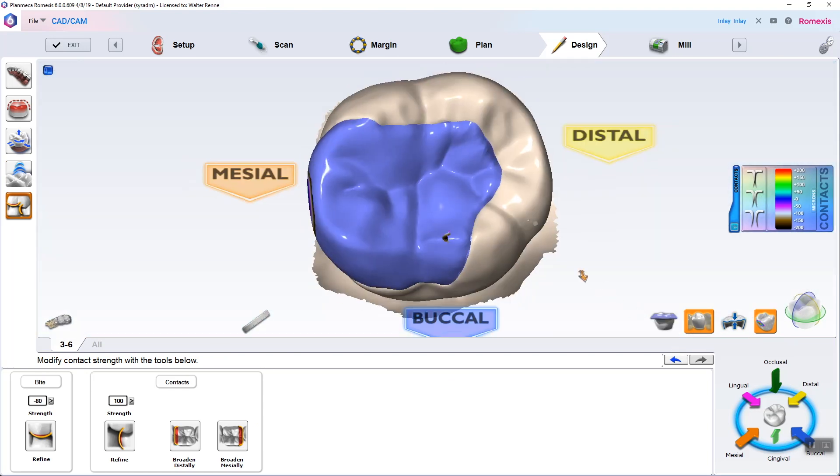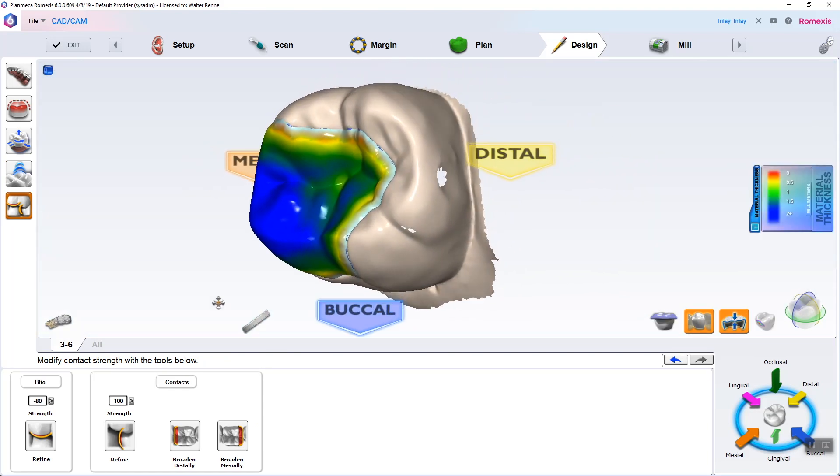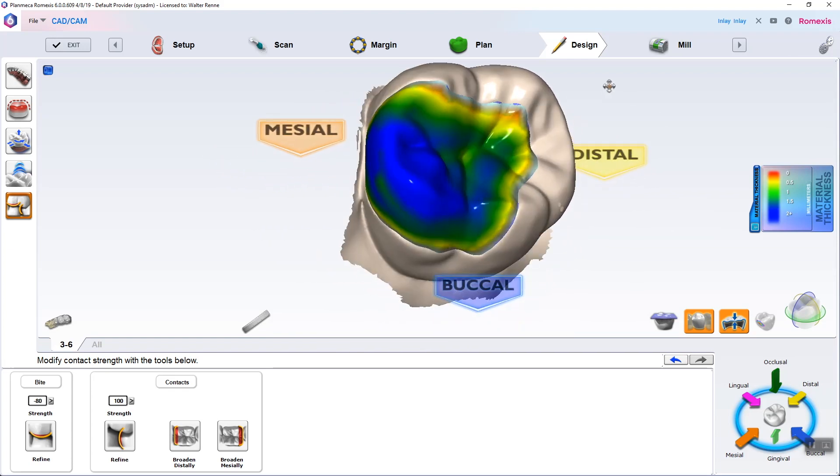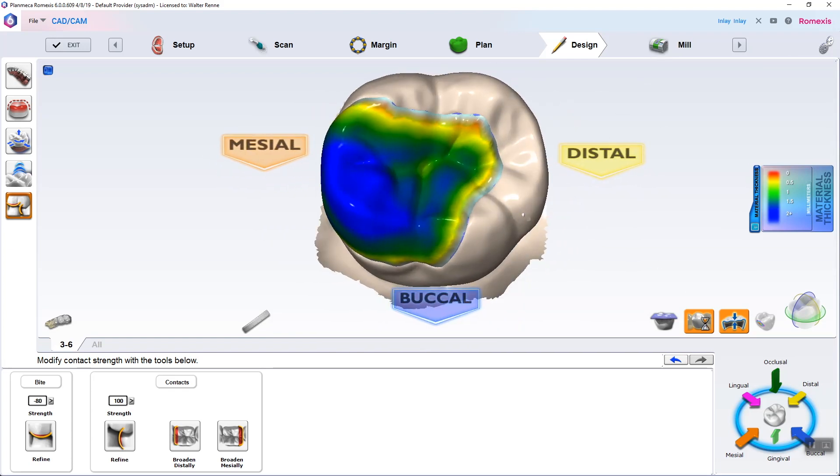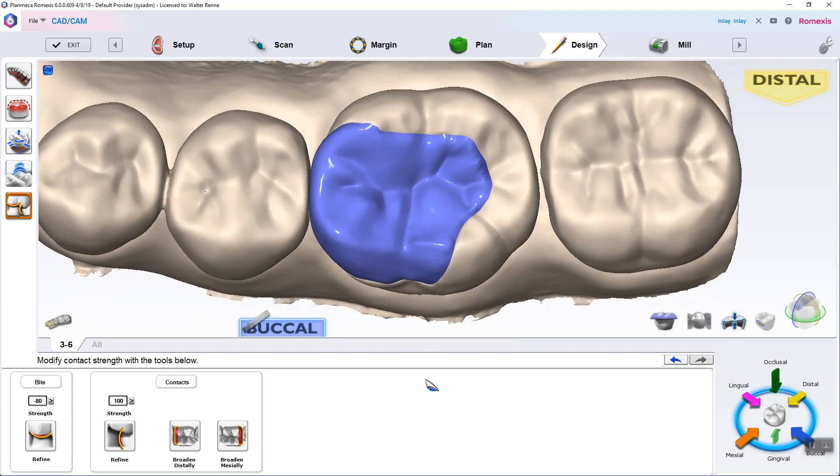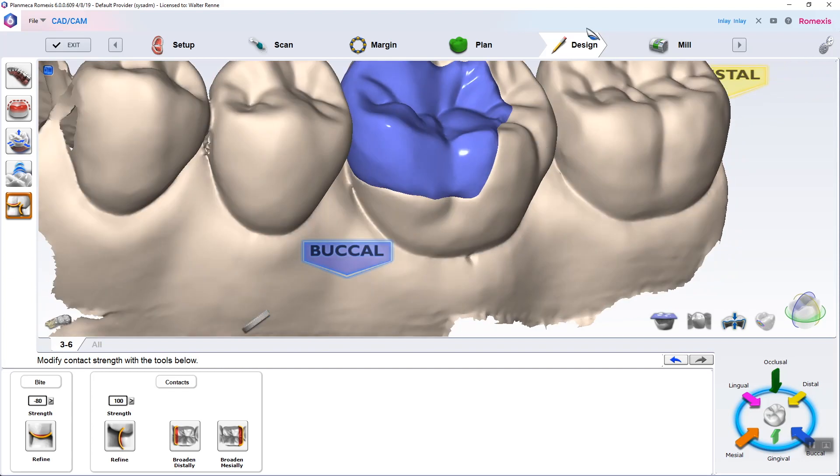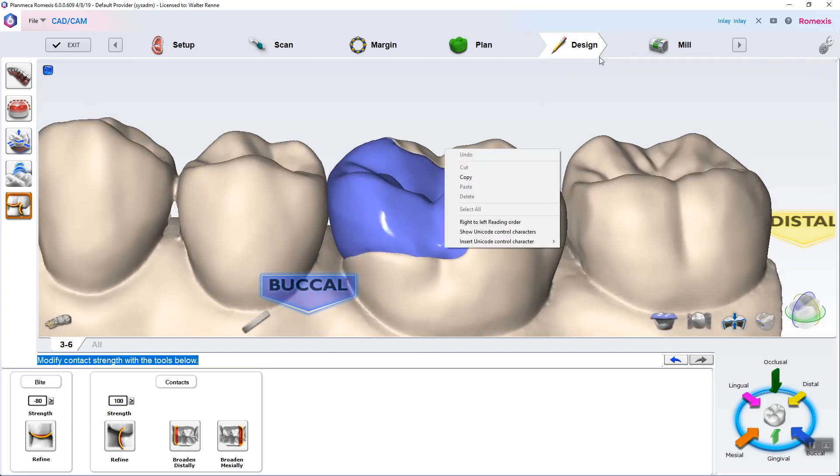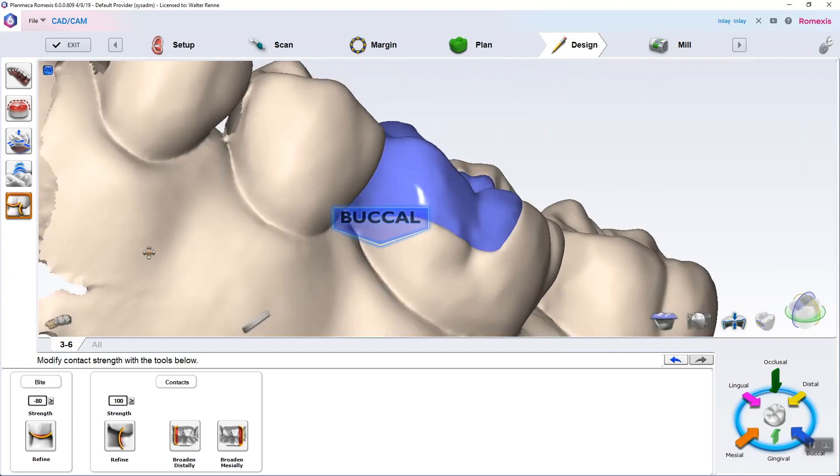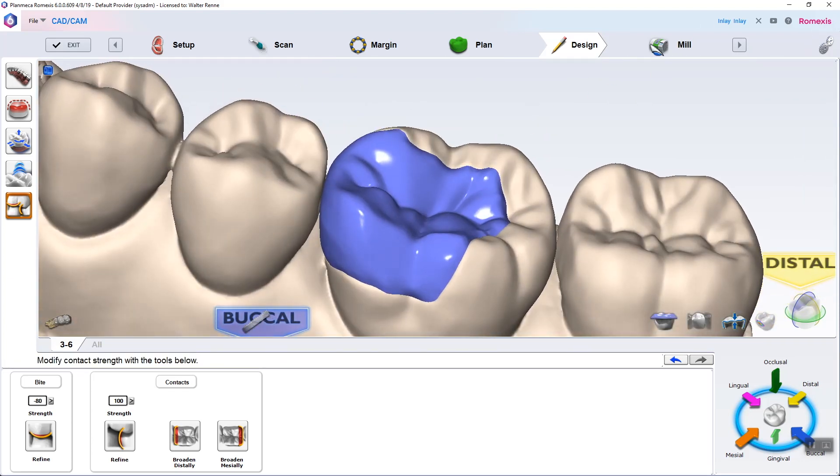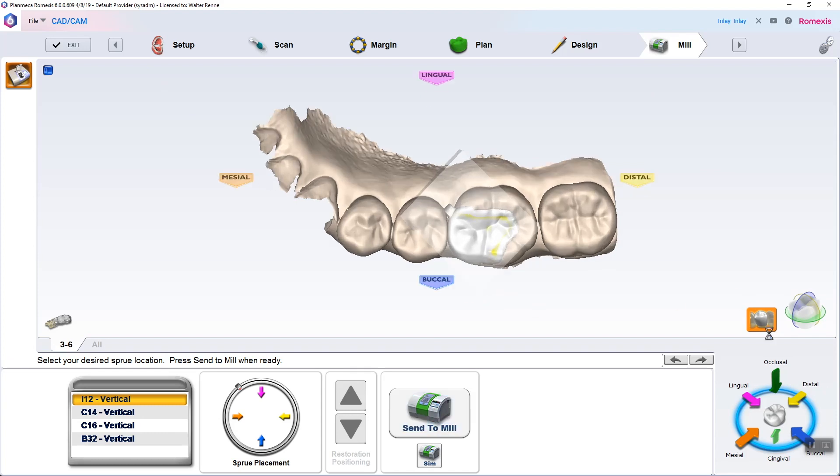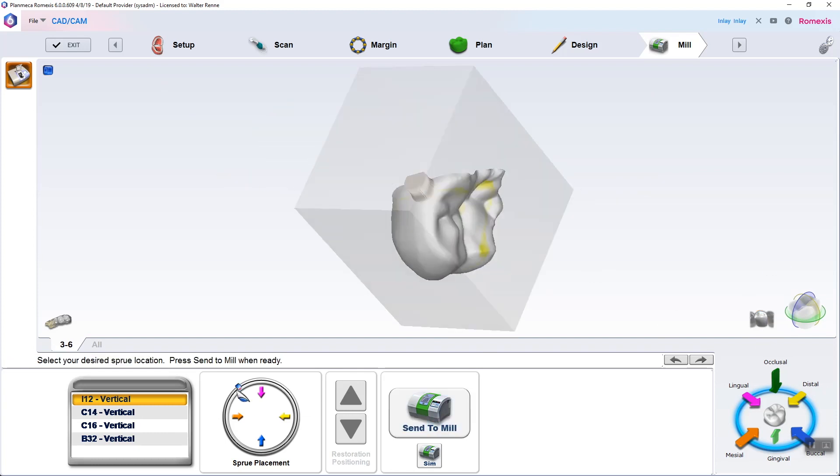Occlusal contacts: hit the occlusal icon twice to turn it kind of semi-transparent. And I'm just going back to the contact refinement tab and circling those occlusal marks, knowing that in this instance, the contact point is right along that margin, which is not necessarily ideal but sometimes unavoidable clinically. And would I go ahead and obliterate the remaining cusps to avoid that? Probably not.